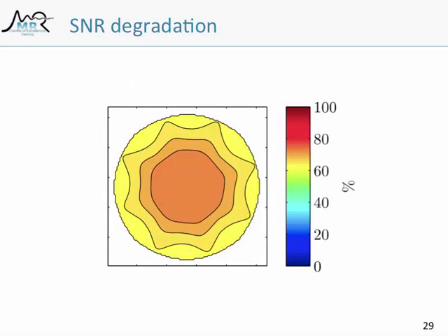And when we look at the ratio, okay, in the center I get something like 70-something percent, maybe 80%. Okay, and in the periphery it drops down to 60%. So using that, you can easily judge, okay, I've got a coil array, it could be this good if it was perfect, but how close do I get to perfect with the coil?